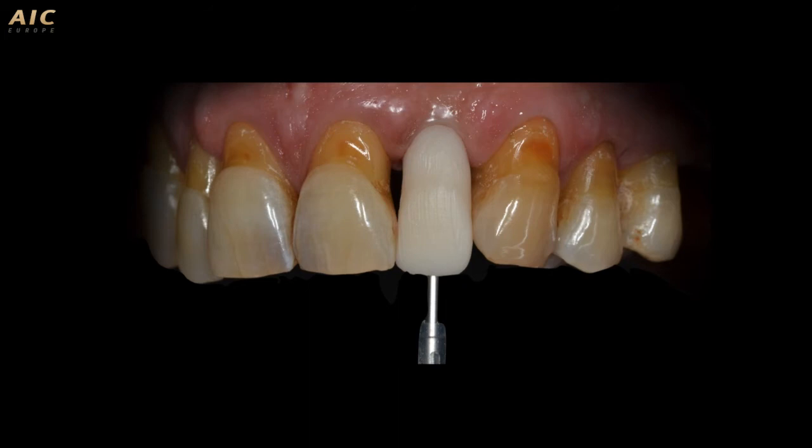3D printers are a great opportunity for our daily practice, because with 3D printers we can have in a short time a prototype, a piece of our crown, of our prosthetic project to try in the mouth of the patient. And in this way it is very simple to try the idea of our work.